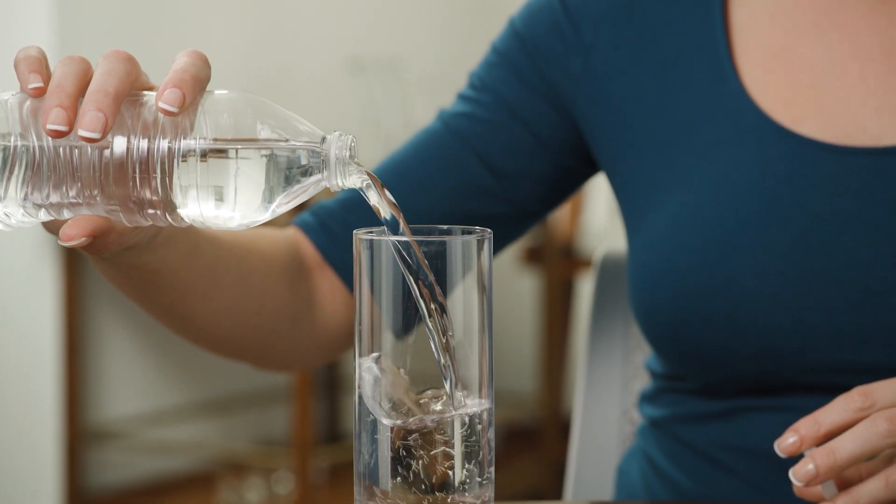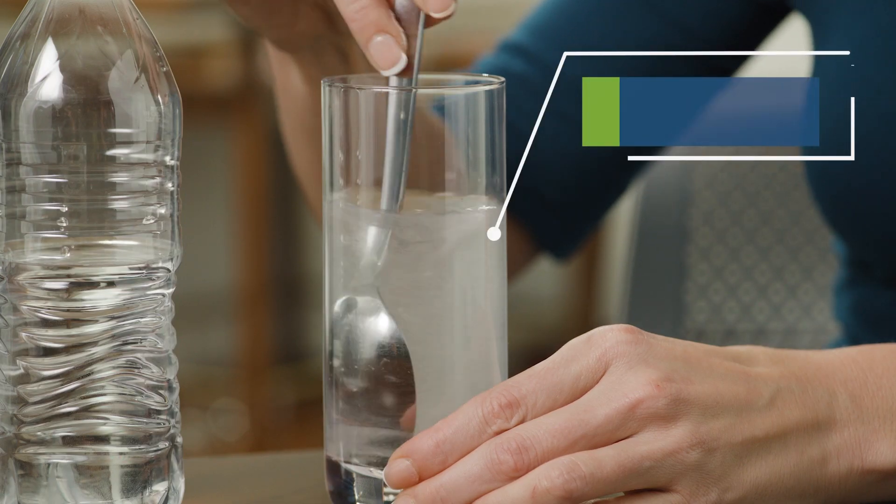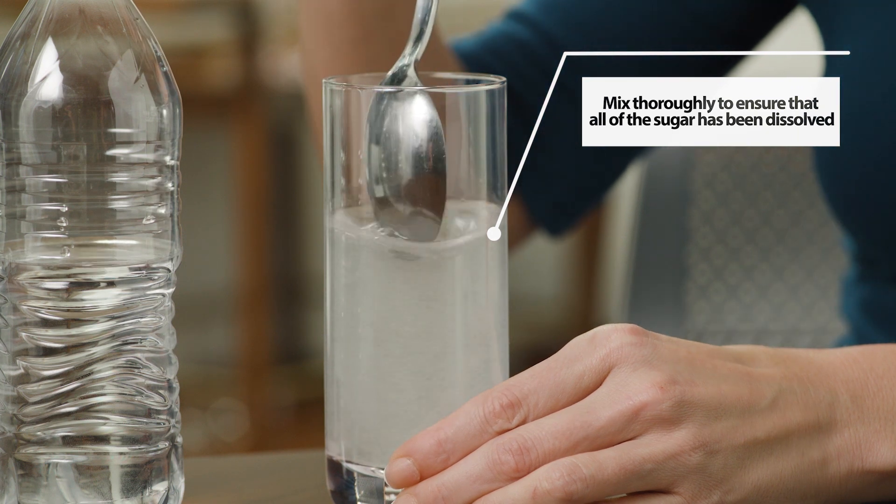Pour 8 ounces of tap or bottled water into the cup. Add the sucrose to the water, mix thoroughly and set aside. Do not drink yet.